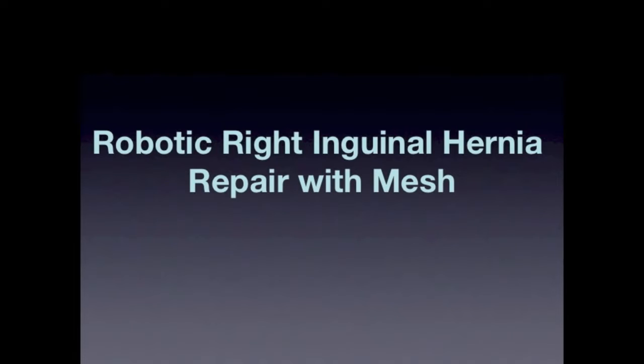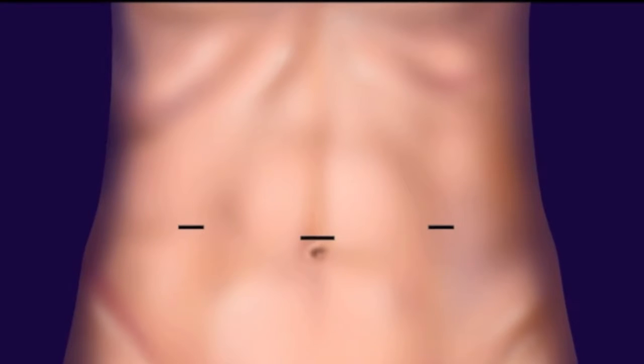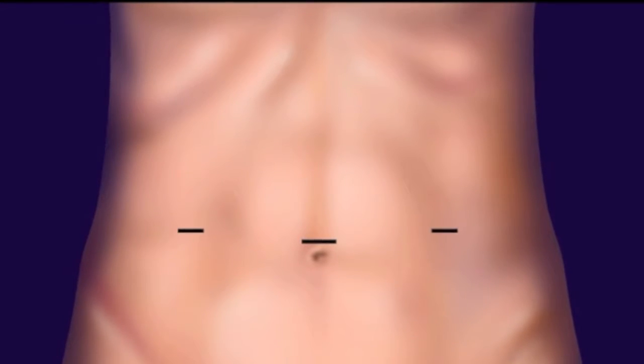Robotic right inguinal hernia repair with mesh utilizing the transabdominal preperitoneal approach. The patient is placed in a supine lithotomy position. We start by using the same trocar setup as in a laparoscopic transabdominal preperitoneal inguinal hernia repair, utilizing two eight-millimeter trocars in the right mid and left mid quadrant, centered by a 12-millimeter trocar for the camera. The robot is then docked between the patient's legs.